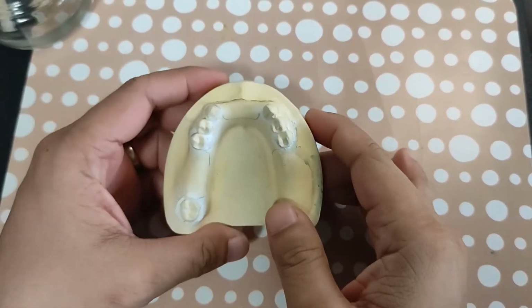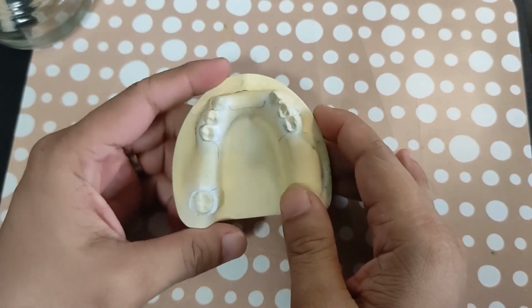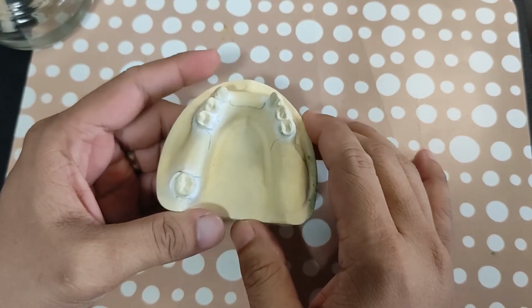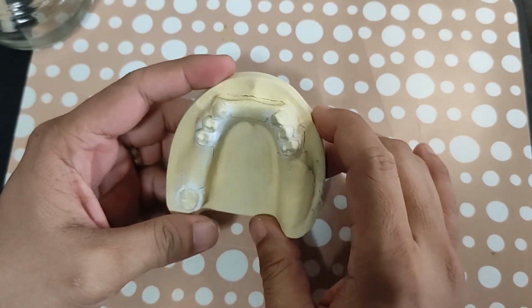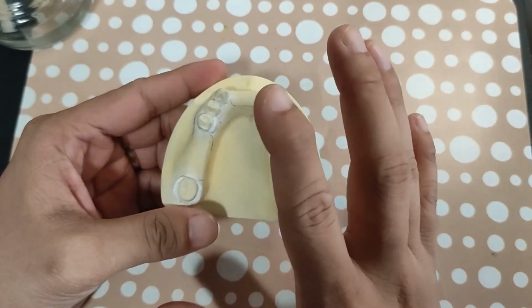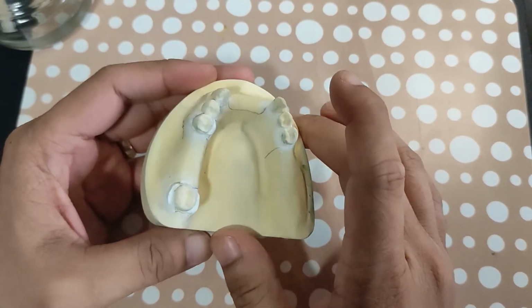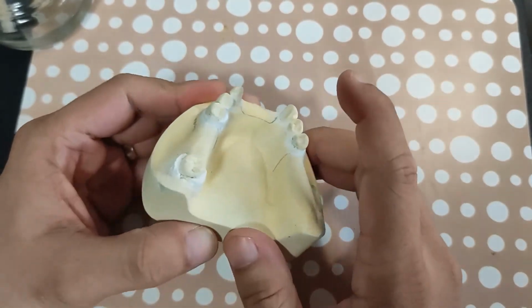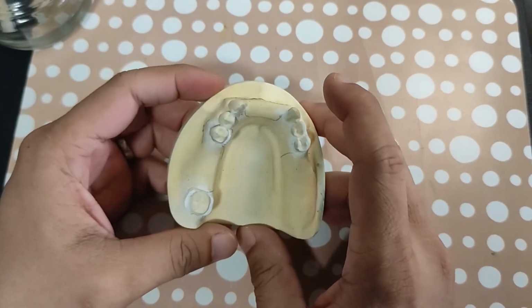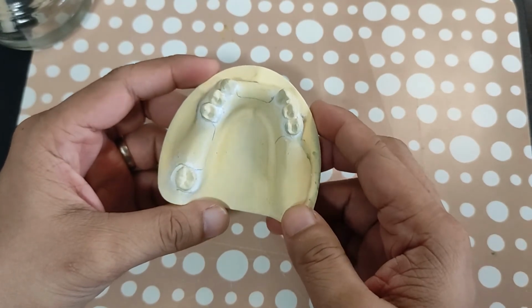Okay, so now we're going to do the wax relief for the lower. It's different from the upper because we're going to use 2 layers of sheet wax here. The first layer is provided so that the major connector or the metal framework does not contact the lingual mucosa, because it ulcerates very easily. And the second layer of the sheet wax is for the relief of the denture base connectors, so that there's space for the acrylic to flow beneath.